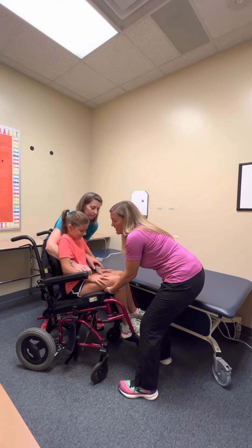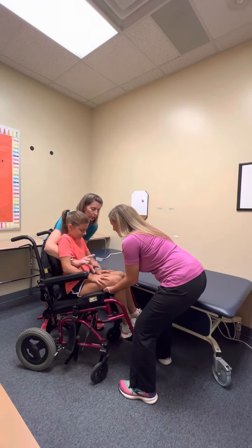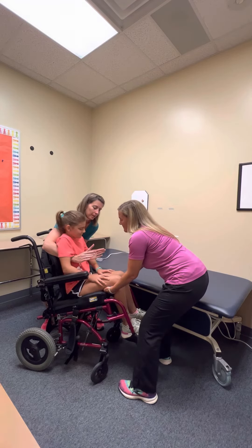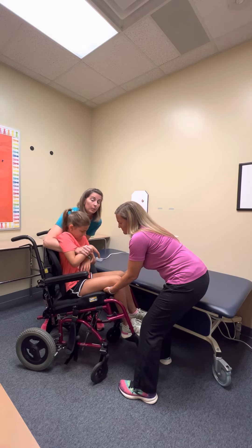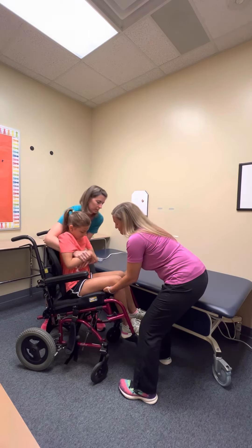We're going to have Karen count and lift on three. One trick you can also do is when you come under the arms, if you can grab their forearms it makes it a lot more strong of a hold for you.